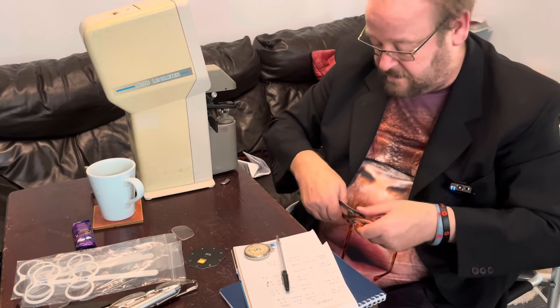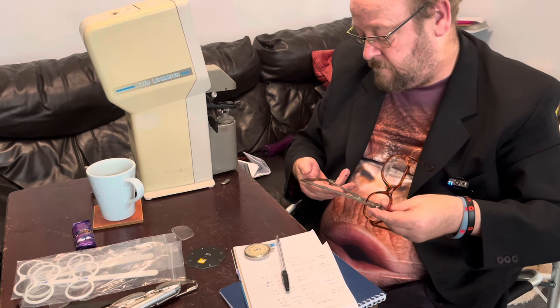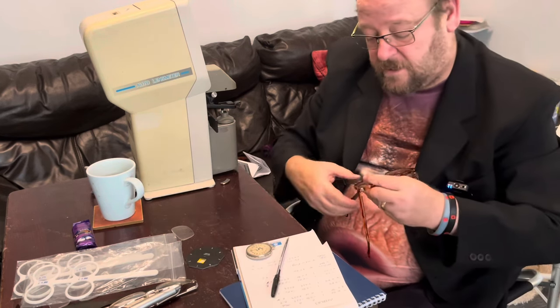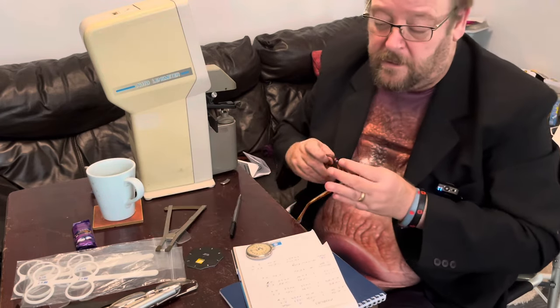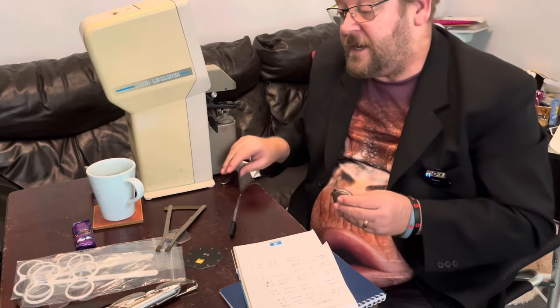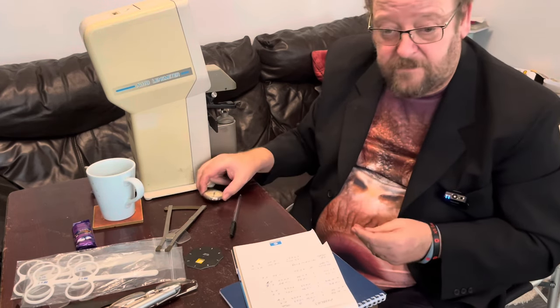And now for the center thickness of the lens. The main part of the lens is 2.1 millimeters, and the segment is three millimeters. So that's showing you that any prescription can be made very differently by changing the front and back surface of the lens. Thank you very much.